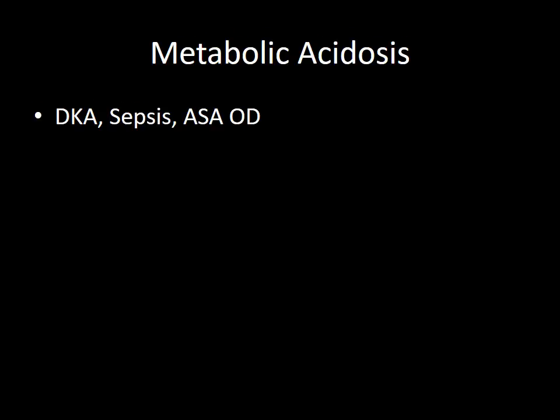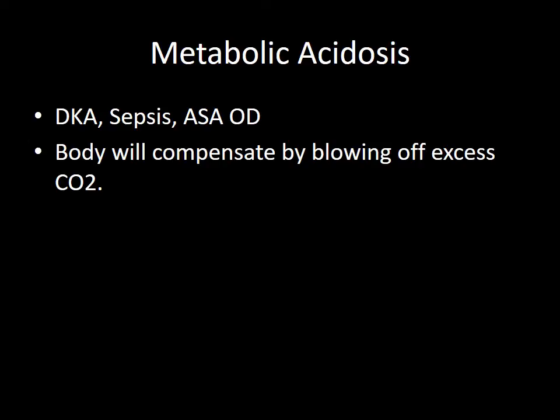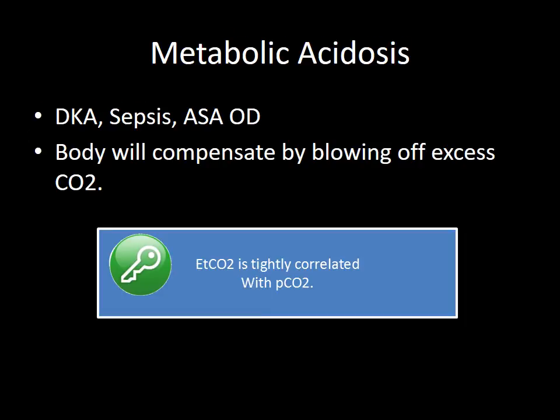You'll see that fast, deep breathing with aspirin overdose. With sepsis, you'll see tachypnea, not necessarily Kussmaul, but the body's compensating by blowing off excess carbon dioxide to make the pH of that blood, or attempt to compensate for the pH of the blood. So end-tidal is correlated with the carbon dioxide level of the blood.